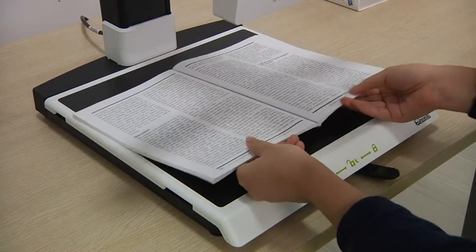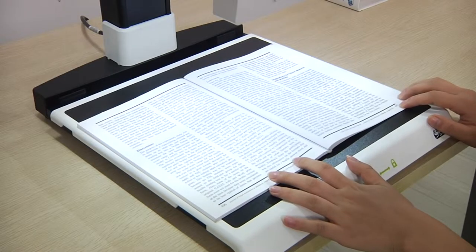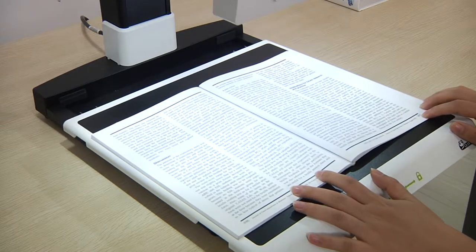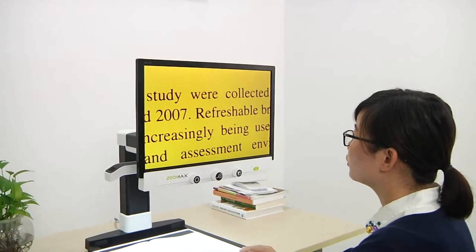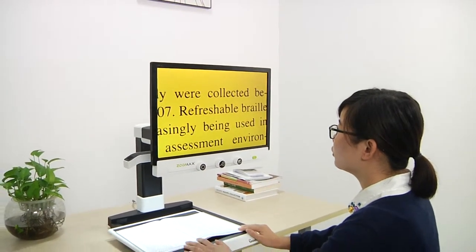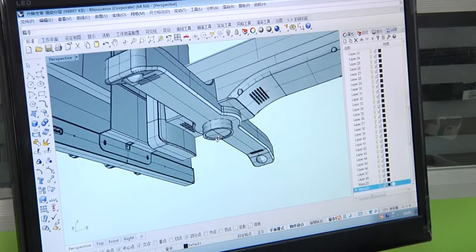Place the reading material on the XY table and power on. Then you could start your reading journey. Reading could be and should be very simple — no burden. That's Panda's design principle, both on the color combination and functions.